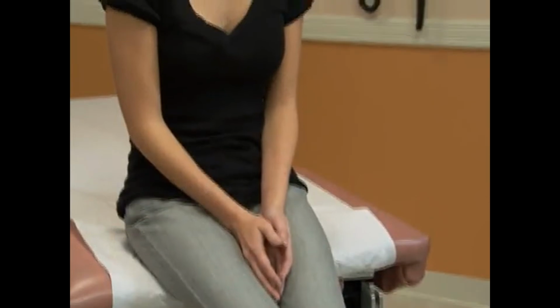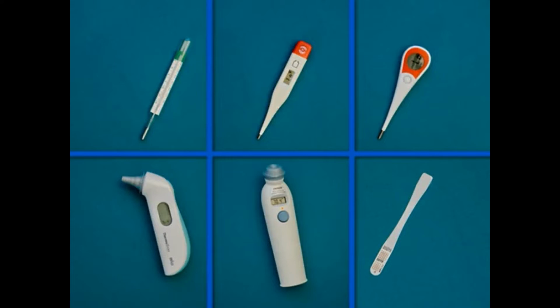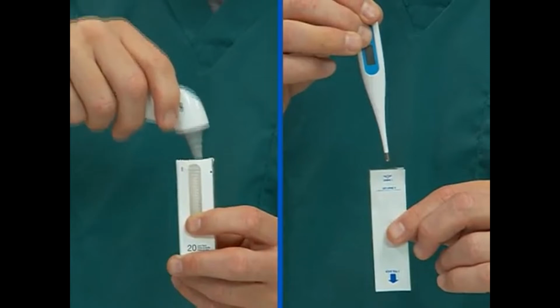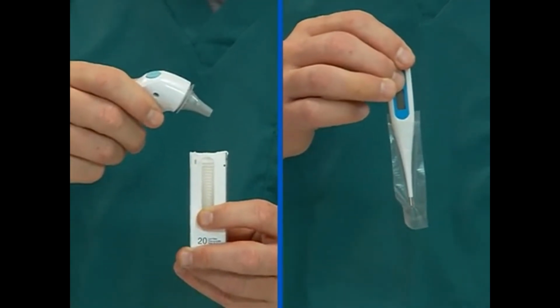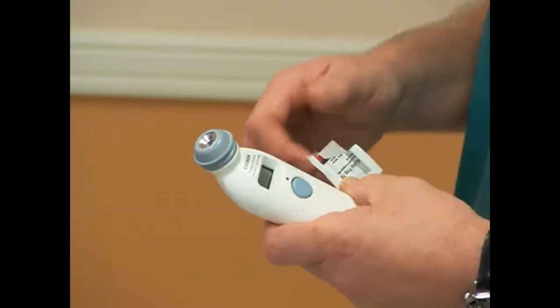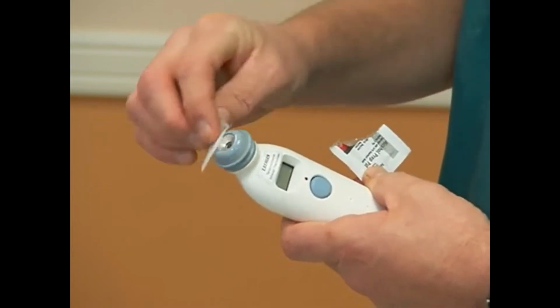To ensure accurate data recording, correlate your measurement with the client's physical activity, age, gender, and state of health, and the time of day. Temperature may be measured using any of several devices. Electronic readings are fast and convenient. To decrease the risk of infection, use disposable single-use tips or covers, or employ a disposable thermometer. Make sure to clean electronic sensors with an alcohol wipe after each use.